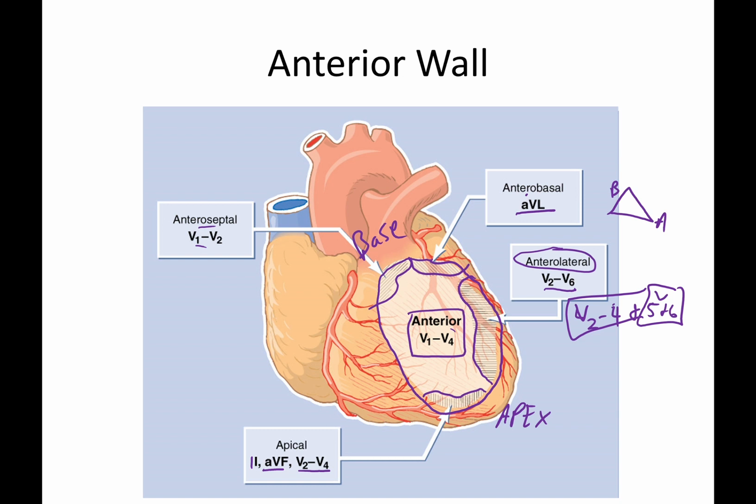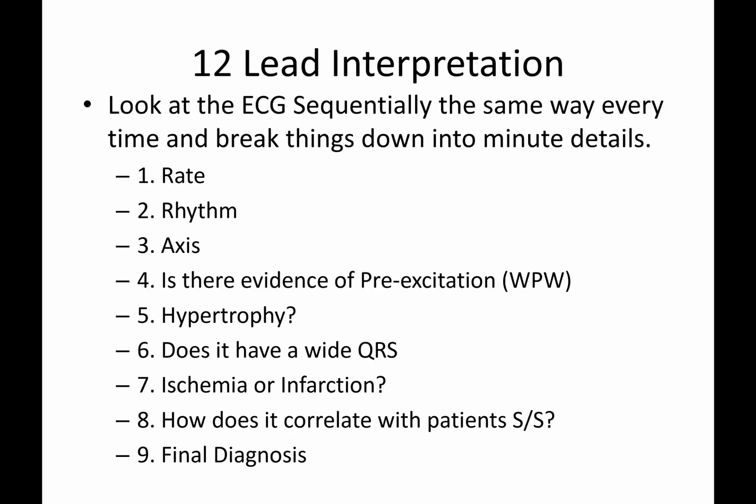That's the bigger concepts of all this that I wanted to go over. Next stop is going to be 12-lead interpretation in and of itself. The next big section we're going to spend a lot of time on is the axis here, because it is a complicated topic, but extremely valuable for predicting other problems. And we will pick up there.